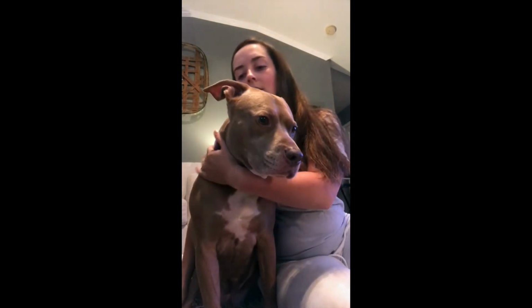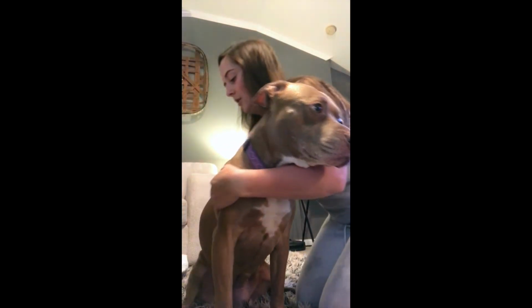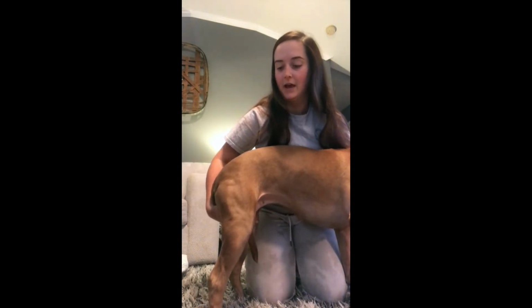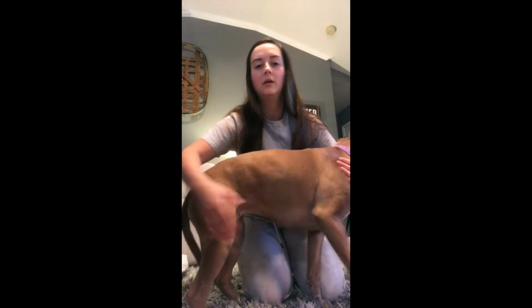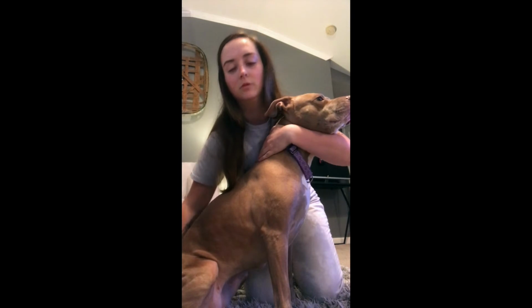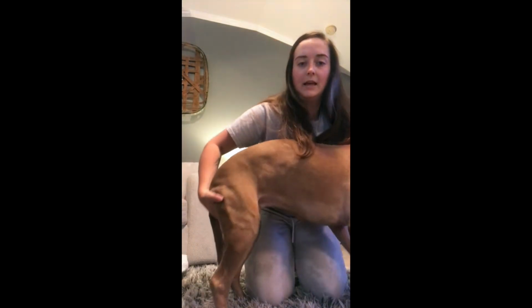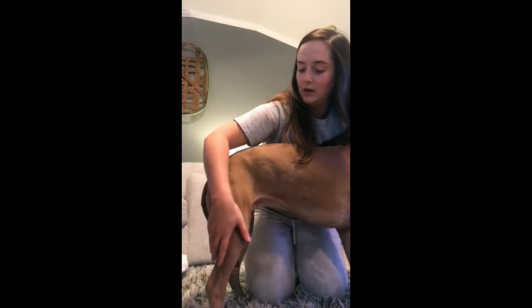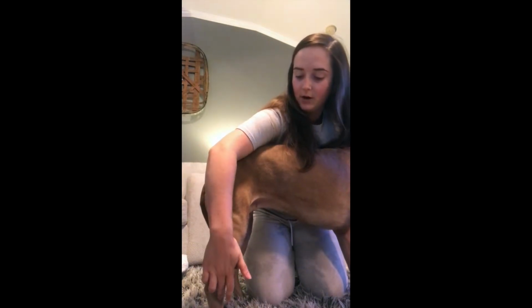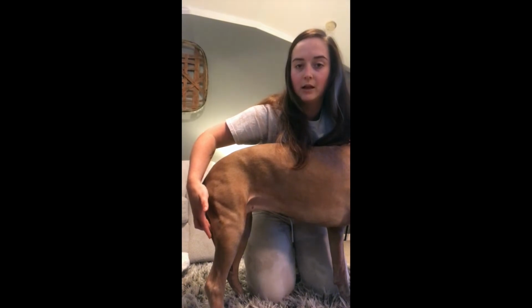For a saphenous blood draw on a dog, you want to have them standing or laterally recumbent. For this large dog, we can have her stand. You want to keep control of her head at all times, so her head can stay in the bend of your elbow, so you can have control if she moves around. And then have her stand to occlude the vein. It runs from her hock to the back of her leg here.